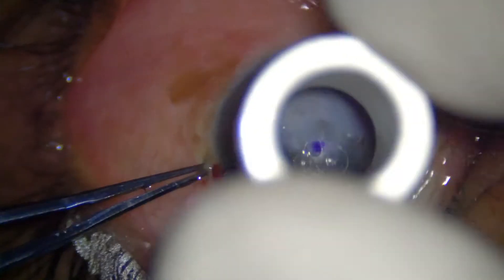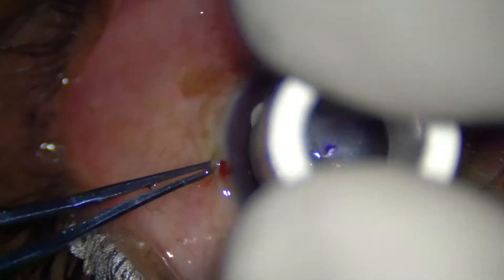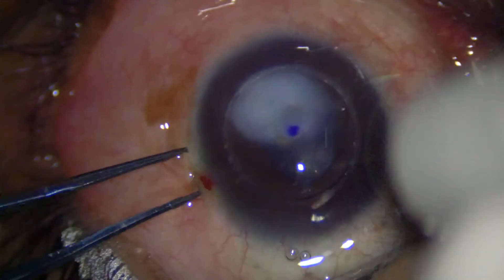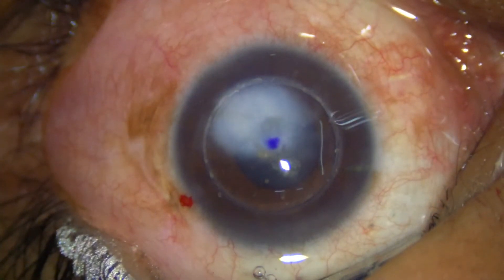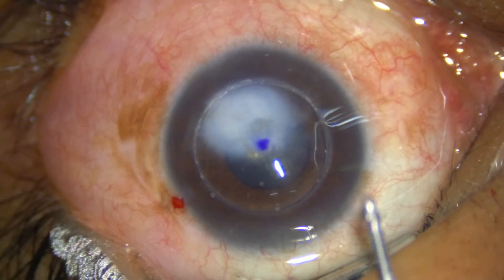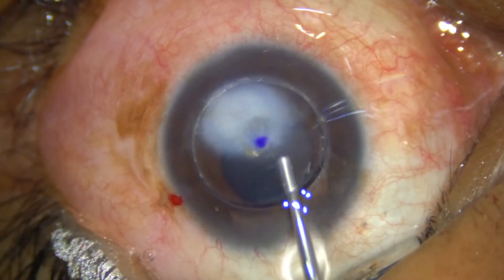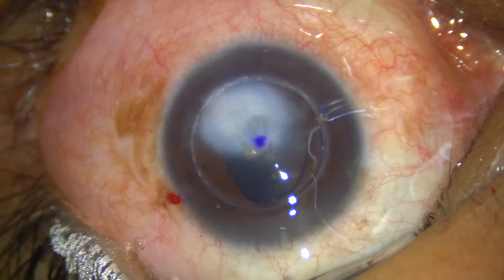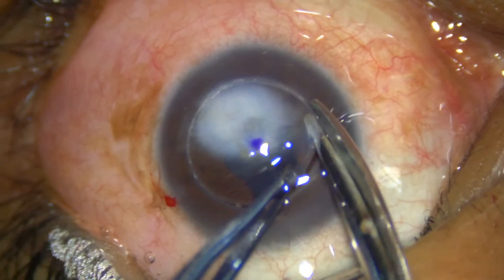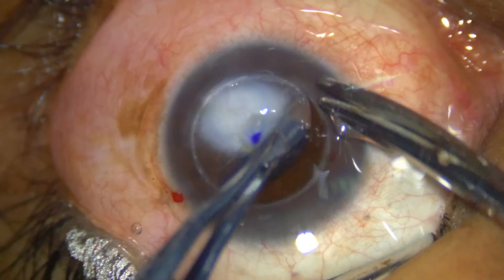Right now I have stabilized the globe with the left hand. I am going to do the trephination with the right hand, in only one direction — clockwise. Once I feel that the anterior chamber is entered, I have stopped and I am injecting a viscoelastic substance to reform the anterior chamber.